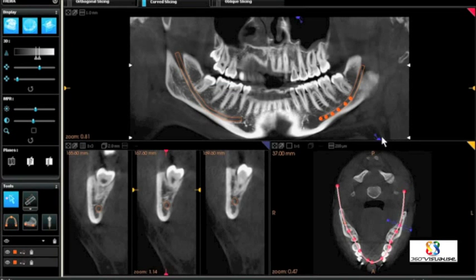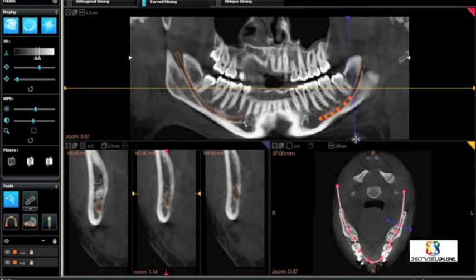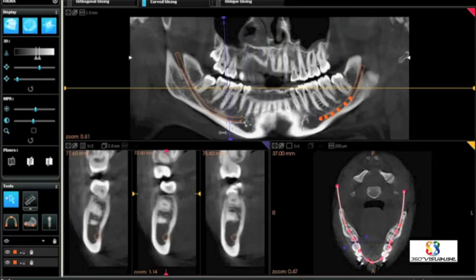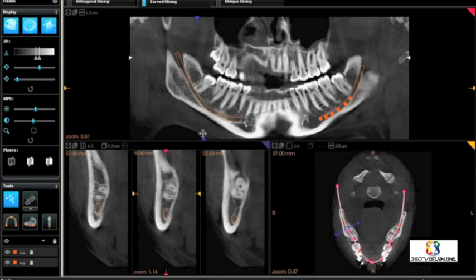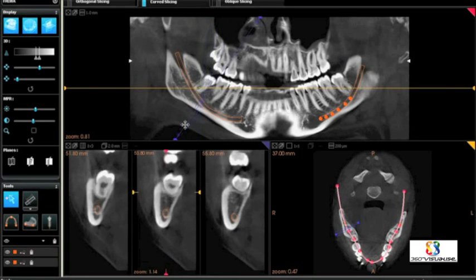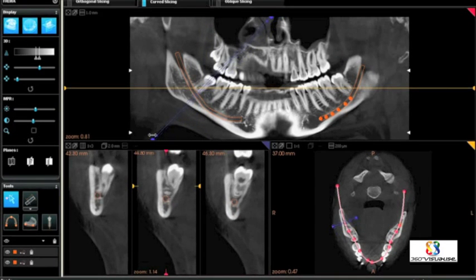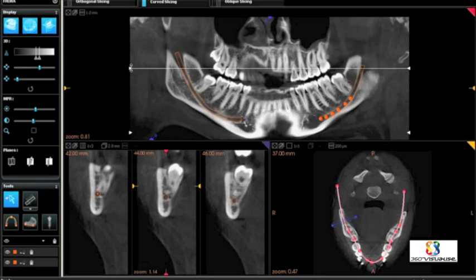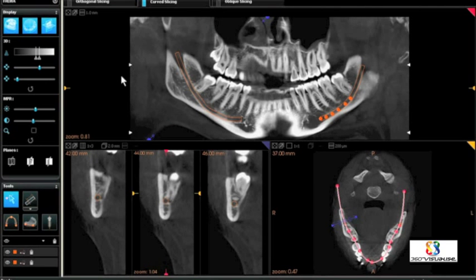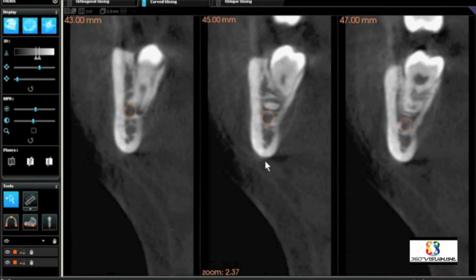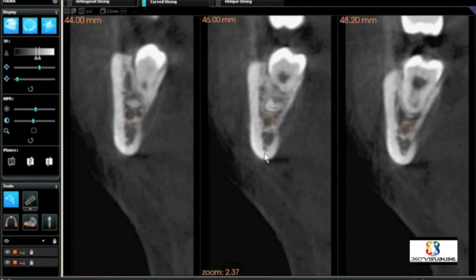We'll do the exact same thing on the patient's lower right. We'll move the cut plane across, angle it so it's down the long axis of the third molar, and we'll enlarge those in a 1x3 format of the cut planes. That allows us to scroll slightly and observe that relationship, which in this case is very, very close.